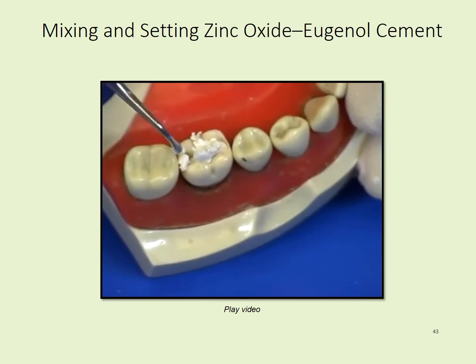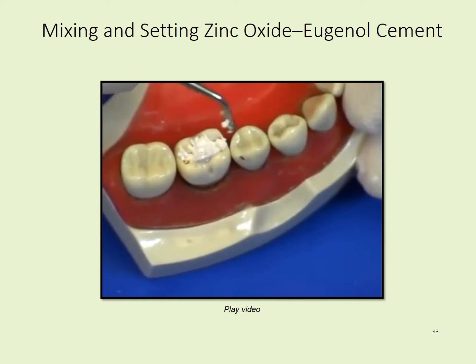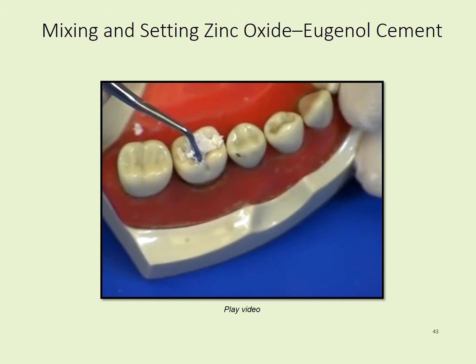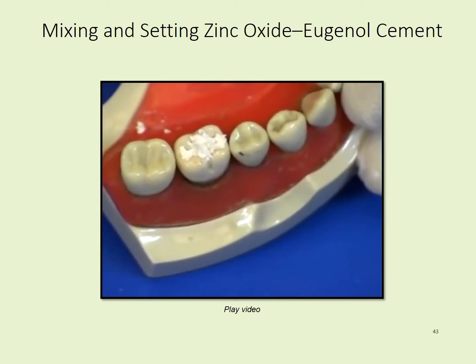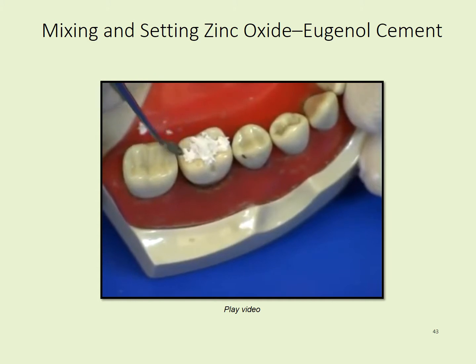Smear the cement against the cavo surface margin to create a seal. Using amalgam carvers, create anatomy in the cement.